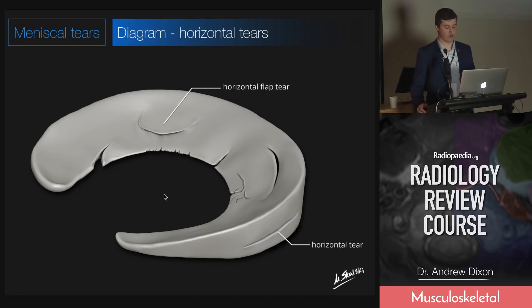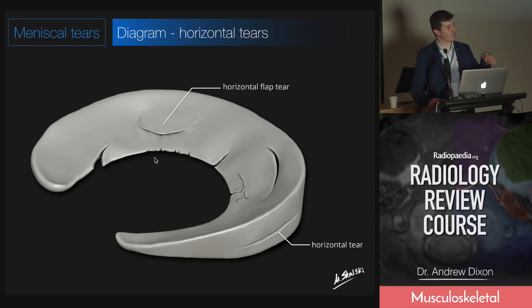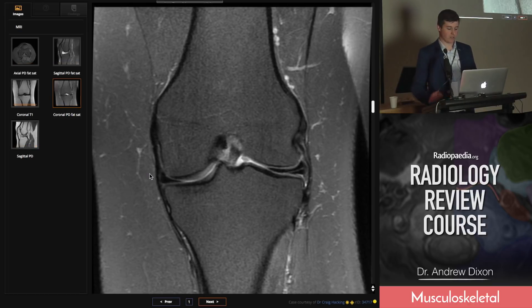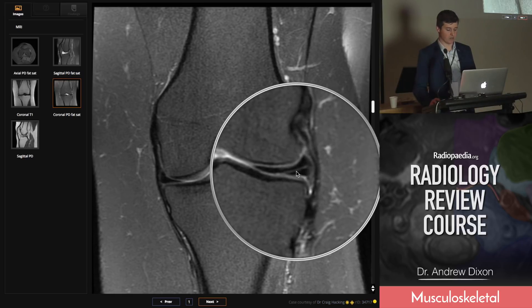Now we're going to go through the different orientations of tears. First, the horizontal tear, which cuts through in that axial plane. Most commonly a horizontal tear doesn't create a flap, but occasionally you get horizontal flap tears where there's an isolated little area that can flip around into unusual spots. Here we have a coronal image showing a classic horizontal tear.